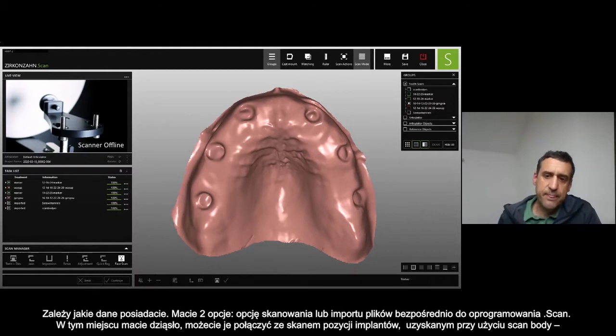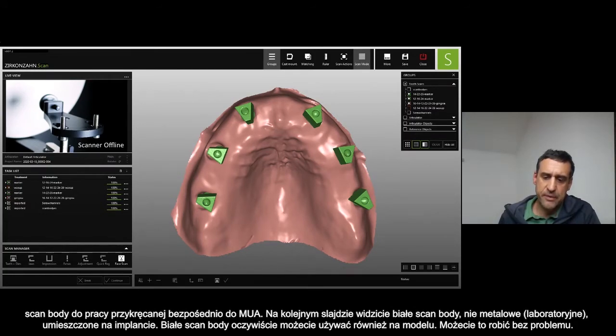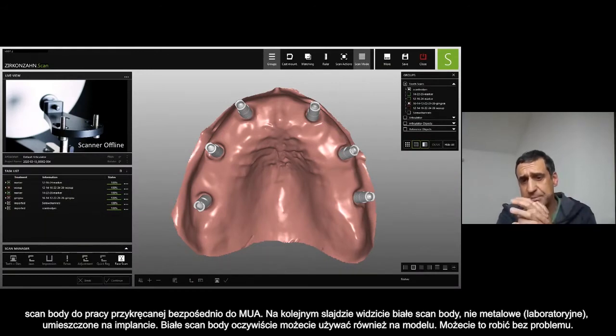You see the gingiva, and then we implement also with the scan body. Here we have the scan body directly on top of the multi-unit abutment. And in the next slide, you can see the scan body — the white one, not the metal — the intraoral white scan body directly on the implants. The white one can be used also in the models without any problem.